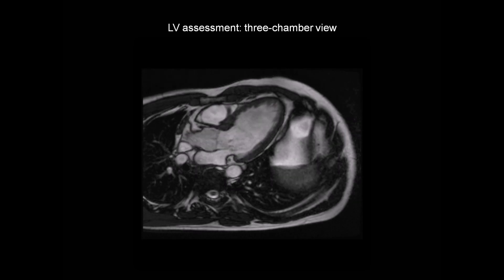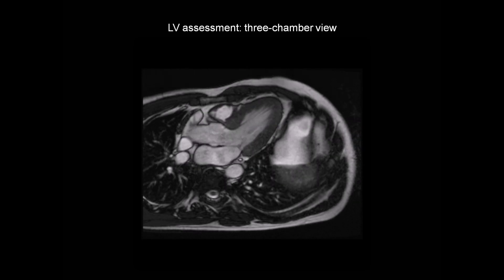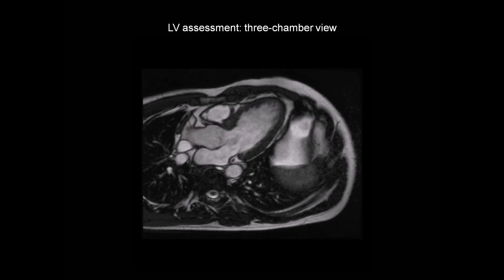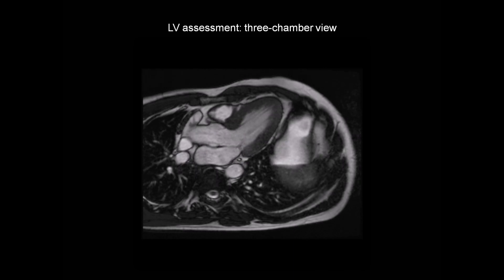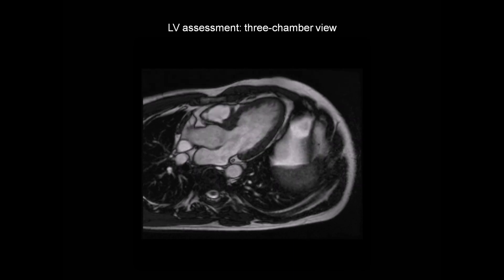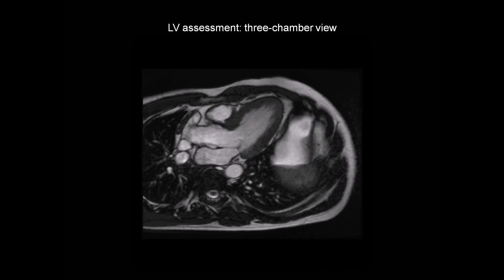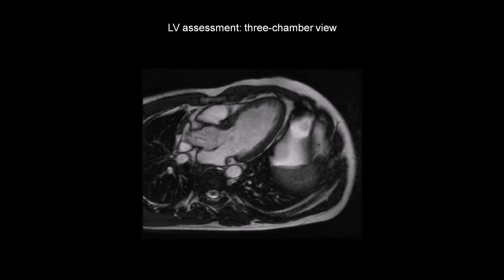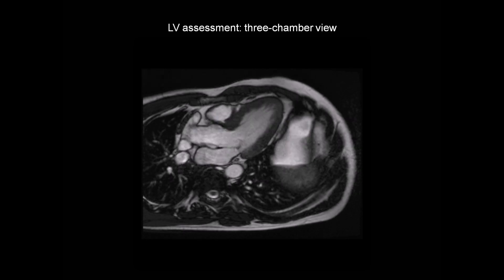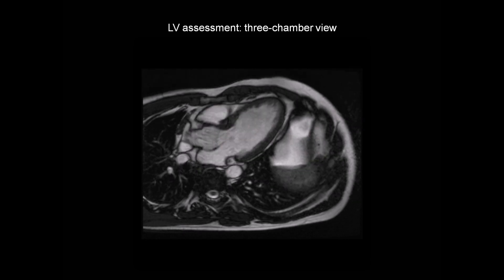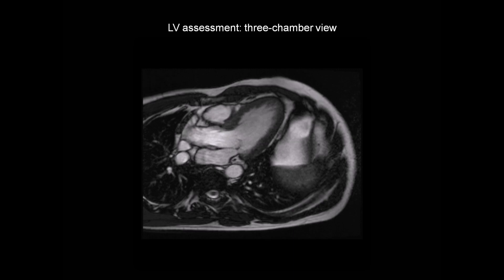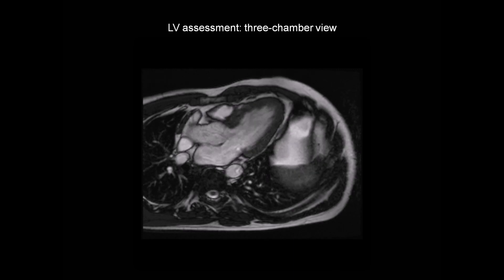Looking at the 4, 2 and 3 chamber views together, we can get an eyeball assessment of overall left ventricular systolic function, and also inspect the regional wall motion of each of the 16 myocardial segments.